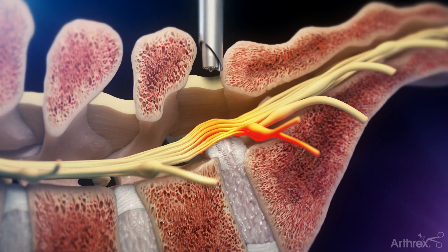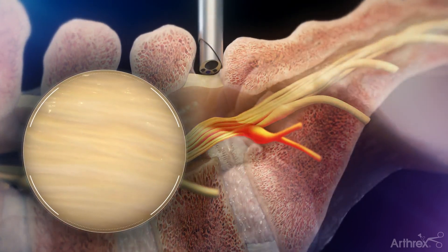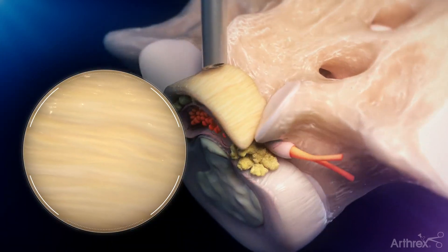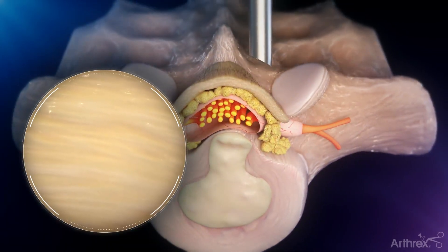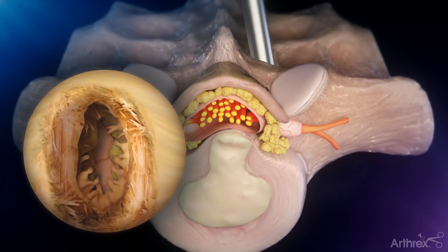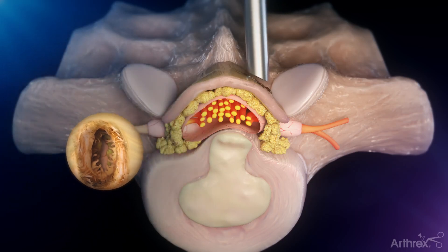Through this cannula, a specialized spine-specific endoscope is introduced to allow for real-time direct visualization of the tissue layer that covers the backside of the spinal canal. A small incision will be made in this tissue layer, or ligamentum flavum, to allow for the endoscope to pass through.